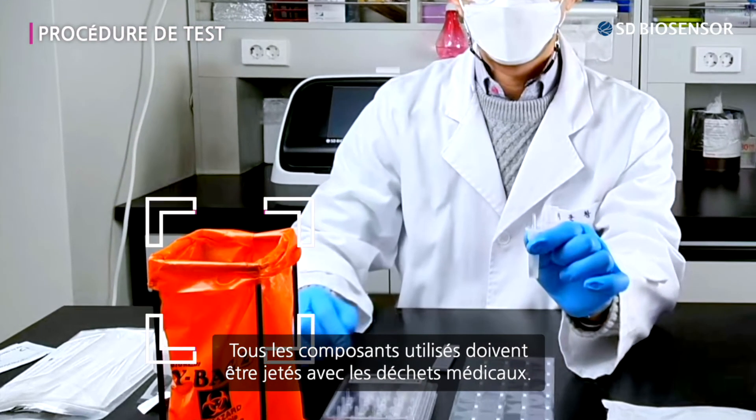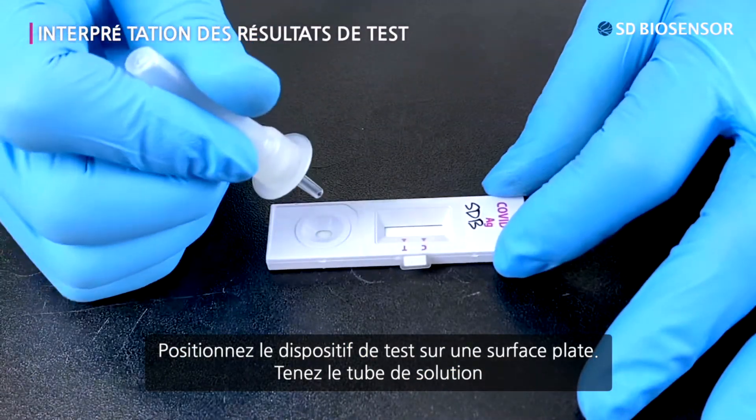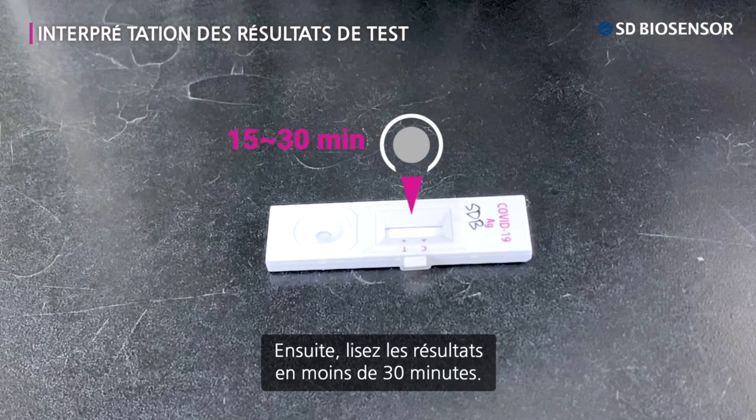All used components should be thrown away as medical trash. Place the test device on an even surface. Hold the prepared extraction buffer tube upside down and place three drops of extracted specimen into the specimen well of the test device. Then read the results within 30 minutes.